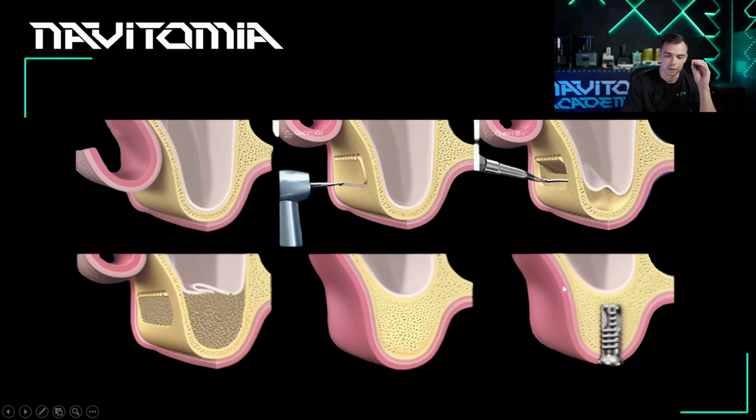If you plan it for open sinus lifting, we just do not care about native bone, because the implantation will happen after the sinus lifting is done. So while planning, we don't care about the borders of the sinus, because we assume it will already be done by the time we place the implants with the surgical guide.